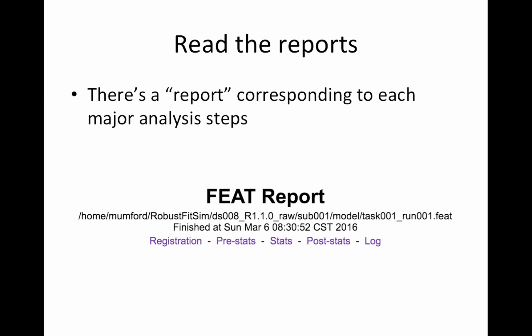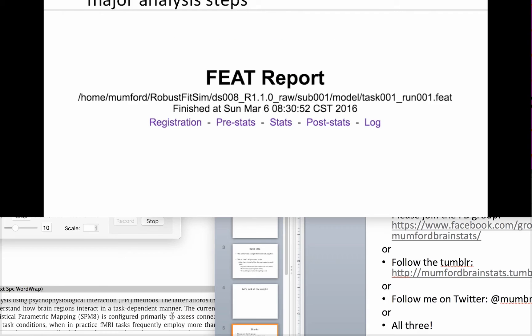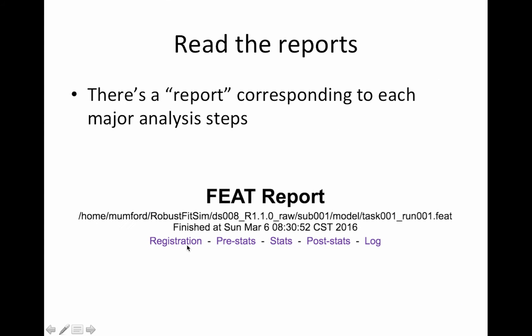So basically, all you have to do is go through the reports that are produced after you run each stage of your analysis. So this is in the HTML output. And you'll see that there's a section for the registration, the pre-stats and the stats, and the post-stats. So when you click on each of these, the top has a little blurb about what you did. And you just copy and paste that into your manuscript and you're done. It even has all the references. So really easy.